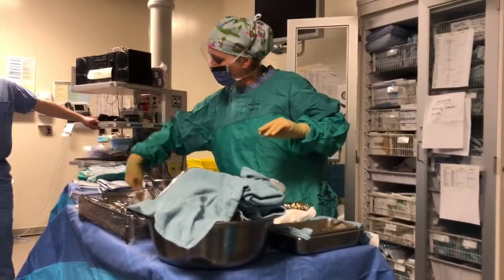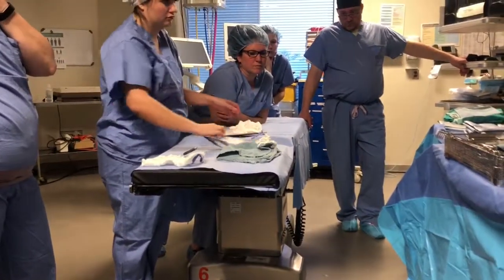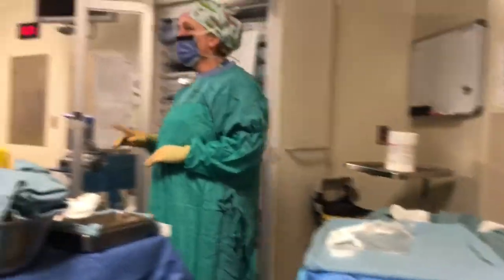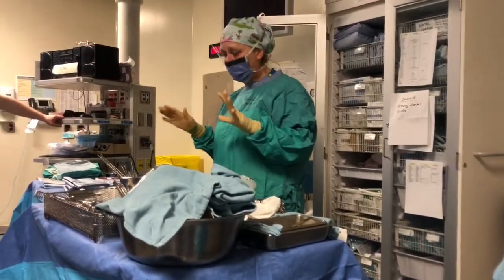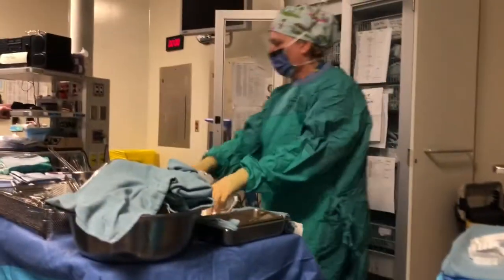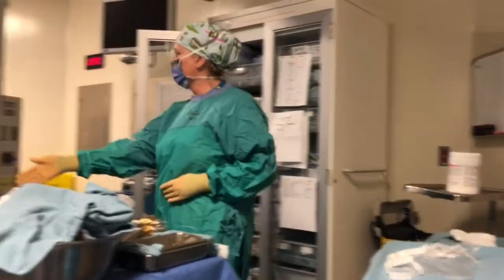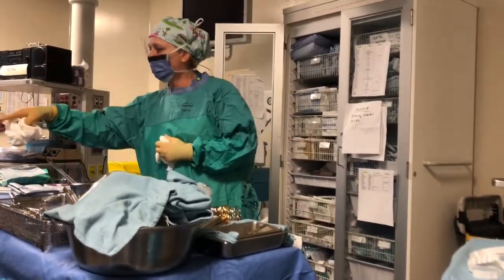Then you're going to go 1, 2, and then spread those out. 3, 4, and 5. Then you're going to count back 1, 2, 3, 4, 5. 1, 2, 3, 4, 5. Now the reason why we do the continuous count, and if you understand this, you'll know why, is because if I went 1, 2, 3, 4, 5, and then I went 1, 2, 3, 4, 5, I don't know where I ended here. So let's say I said, oh, I ended here. So 1, 2, 3, 4, 5, 6.